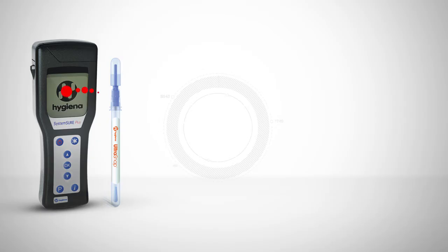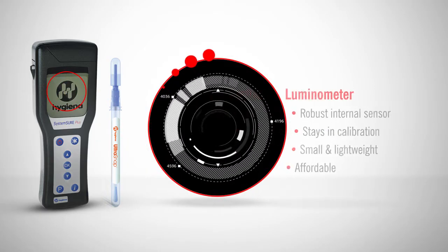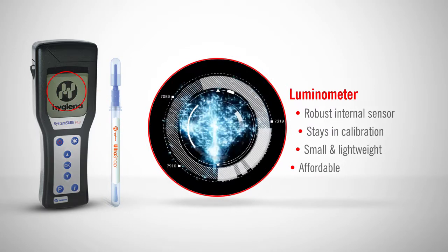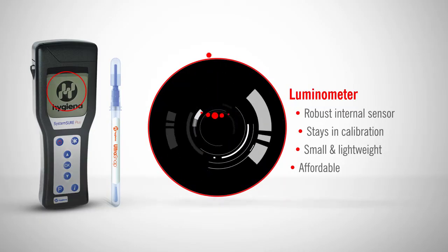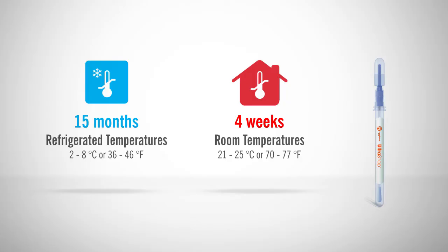The Luminometer uses a small yet robust internal sensor that stays in calibration and allows our device to be small, lightweight, and affordable. UltraSnap has a shelf life of 15 months at refrigerated temperatures and 4 weeks at room temperature.